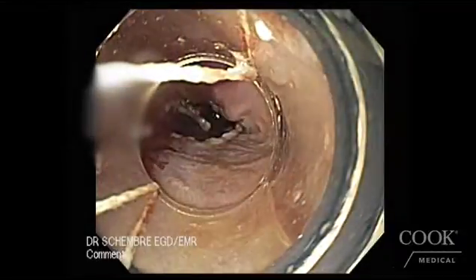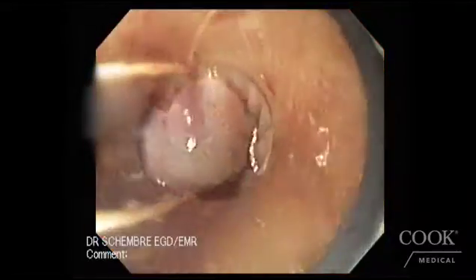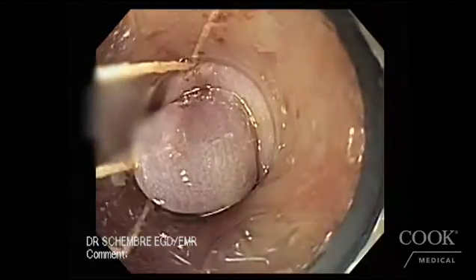Now the upper margin of that abnormal tissue right about here, and pop another rubber band on that, with our abnormal tissue.